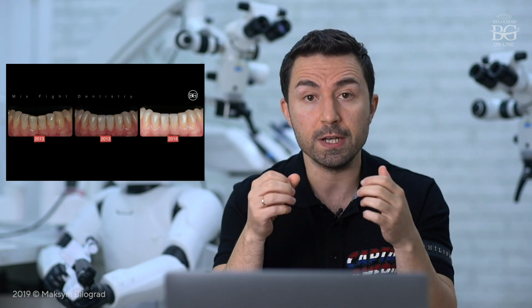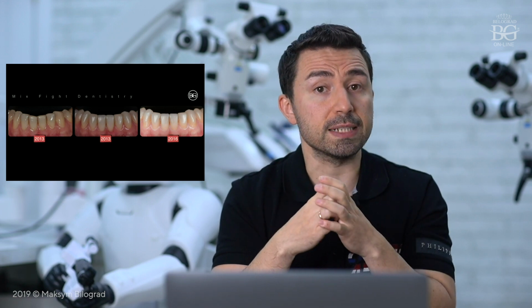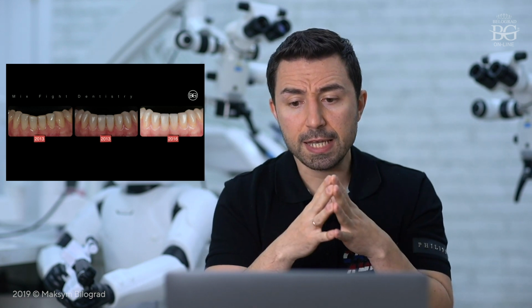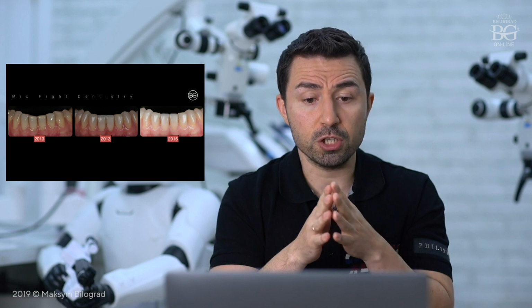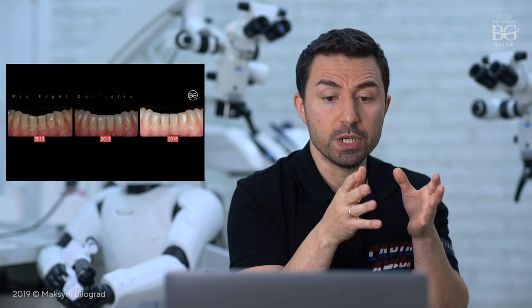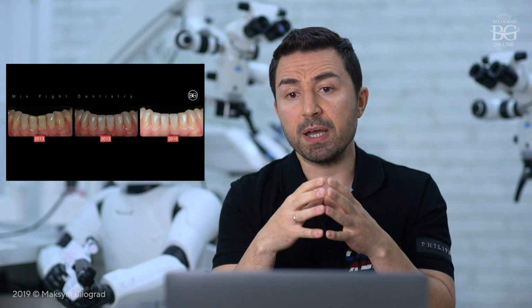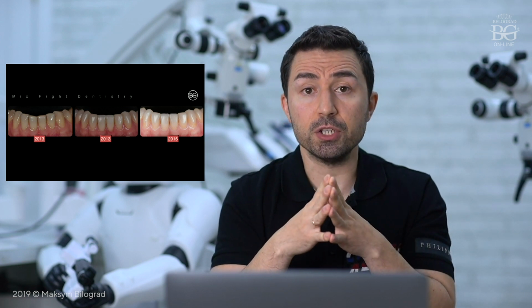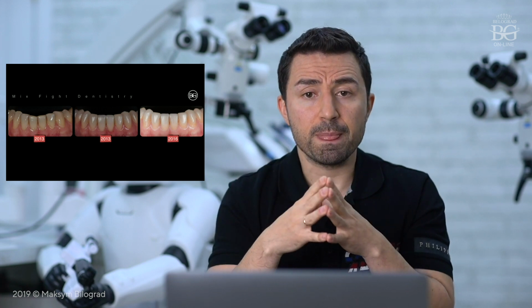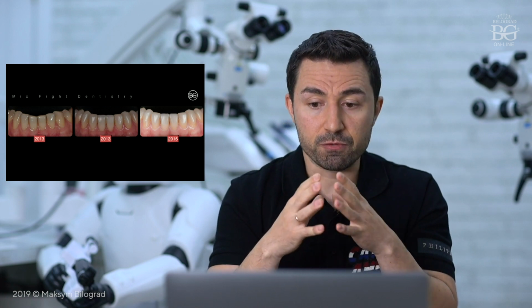We designed, we evaluated the length of central incisors utilizing templates, golden proportions. So we did some digital smile design first. Then we transferred this information to the dental technician. In this case, we decided to go into deprogramming. We defined CR at that time, then we got the wax up, and then we transferred the wax up by use of transparent silicone indexes with a copy-paste technique, utilizing normal packable restorative material.